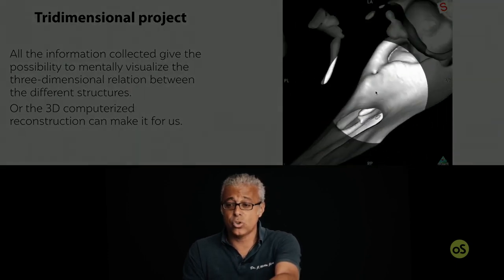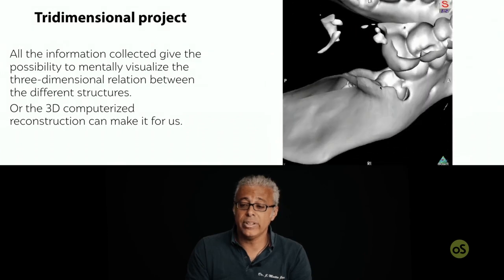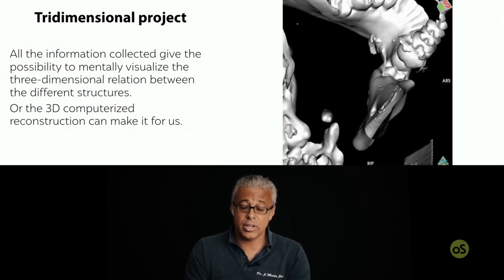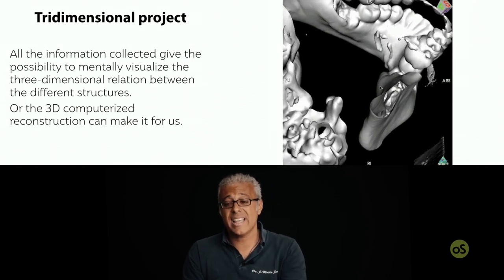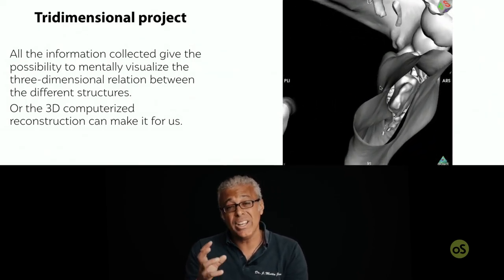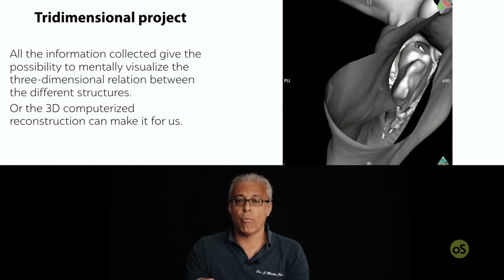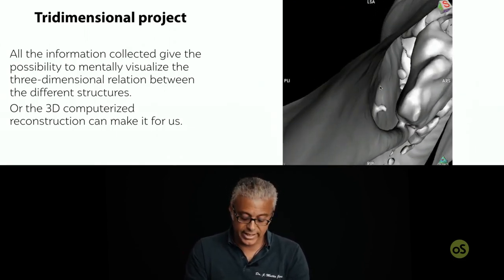And in this case, we also see a small bony vessel that we saw in the surgery actually. So this kind of 3D planning gives us a really good image of what we're going to find once we have our scalpel in our hands.